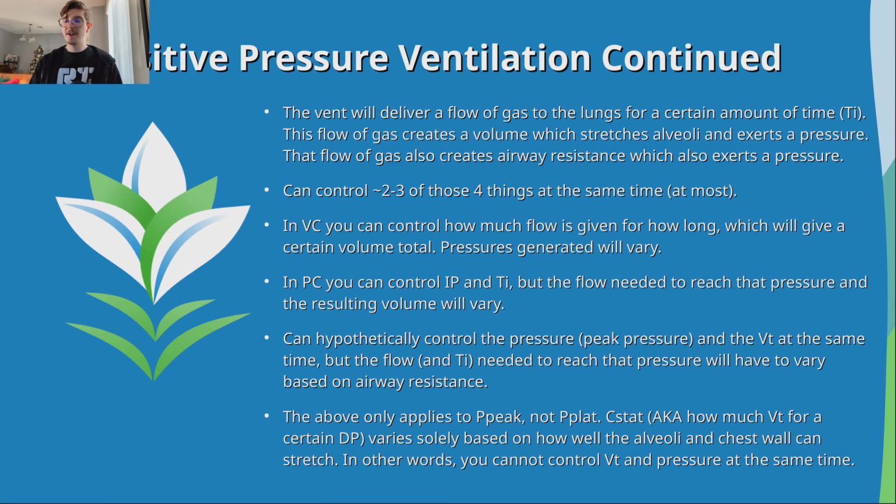Some ventilators, like say servo ventilators, you actually set I time instead of flow. But once again, same thing. You change the I time, the flow is going to have to change because the volume is fixed. And the ventilator doesn't care about what pressure that flow and that volume is generating.